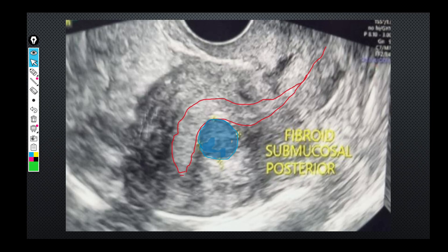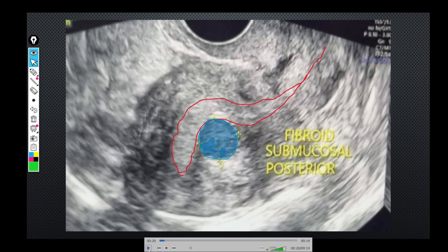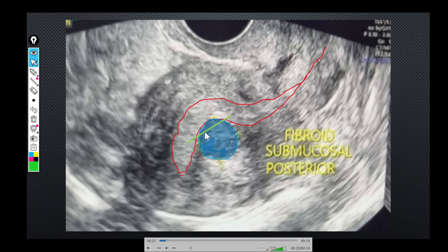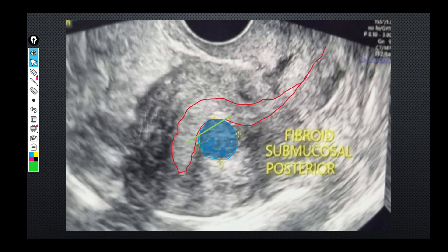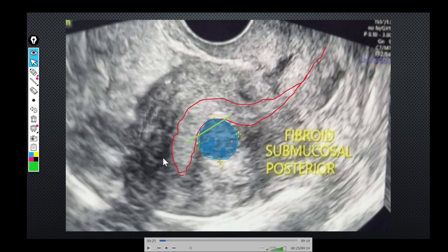In the next slide you will see that though there is a certain projection of the myoma visible on ultrasound, once you actually start doing the hysteroscopy you find that you are only going to see a small projection inside the uterine cavity. That means the majority of the myoma is going to be intramural, and you are going to have to actually scoop it out from inside the myometrium if you want to do a complete job in one single setting.